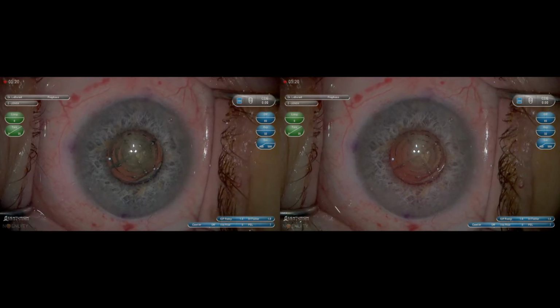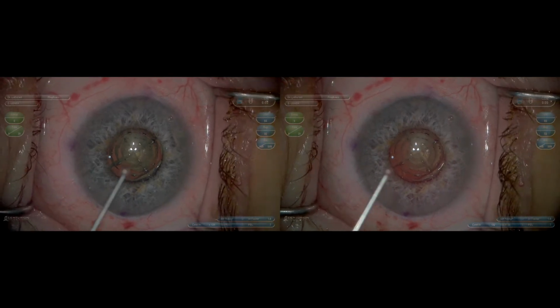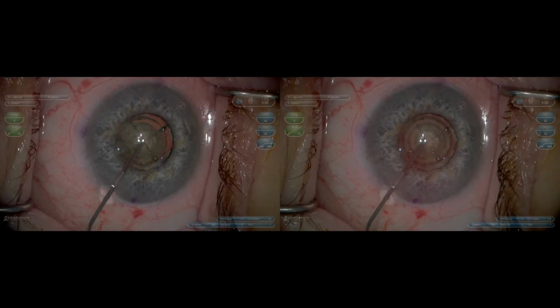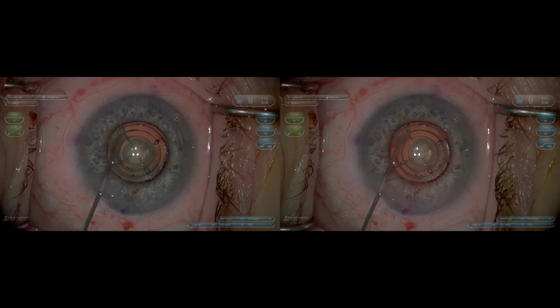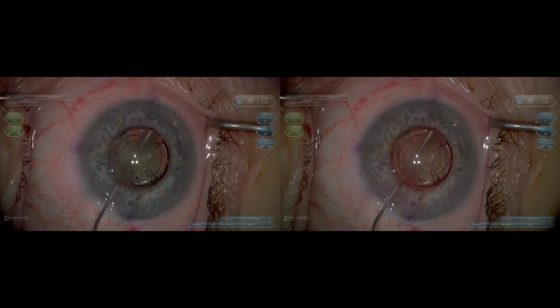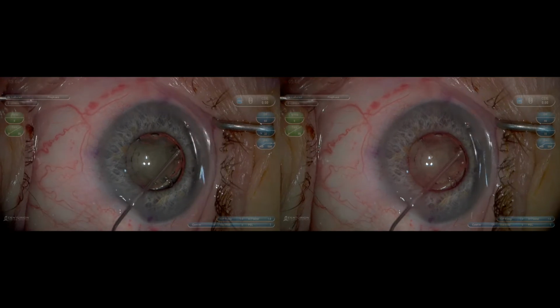It doesn't hurt that you're working off of a 55-inch monitor, that you sit 4 to 6 feet away and you can recline or sit in any position. Sometimes in tricky situations where you're trying to get your phaco tip or I/A in hard to reach areas, you actually need to adjust your shoulders and elbows, and not being stuck in the oculars allows you to do this.